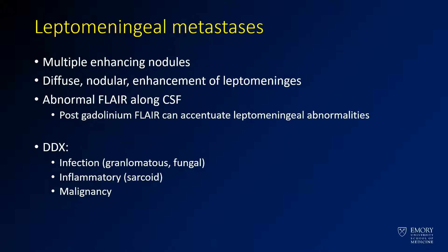For this case we have metastasis with leptomeningeal disease. This patient has a number of enhancing nodules in the brain and there is diffuse nodular enhancement of the leptomeninges. You can also see abnormal FLAIR signal along the CSF. When you have leptomeningeal enhancement, you want to think about infection, inflammatory conditions like sarcoidosis, and malignancy.